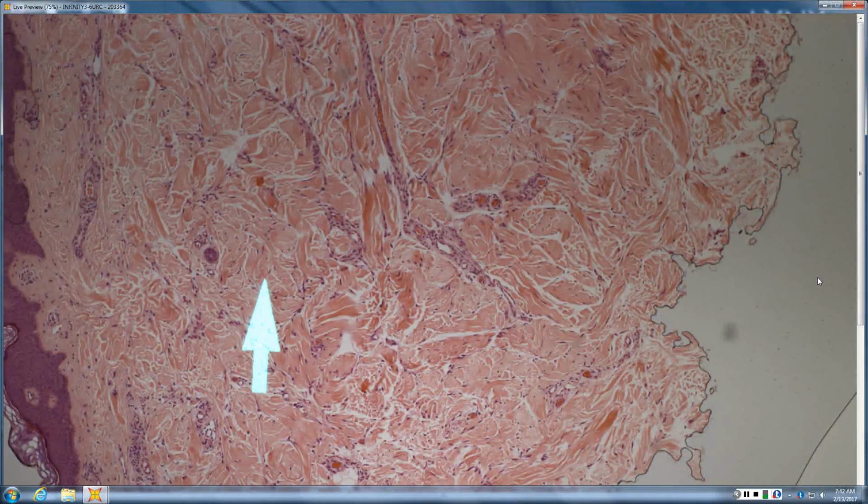The other thing with those being just sort of big, thick, haphazard collagen bundles is what if this is a collagenoma of some sort? So if it were big and deep, you'd think of nuchal-type fibromas that look like this, or when it sits just up in the dermis and it's just a dermal plaque, then connective tissue nevus.